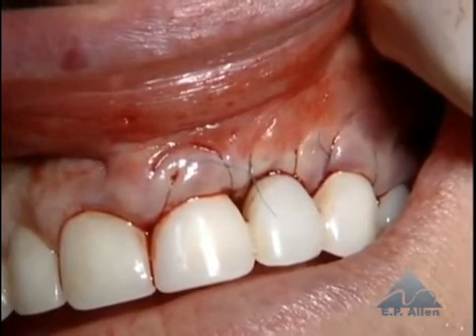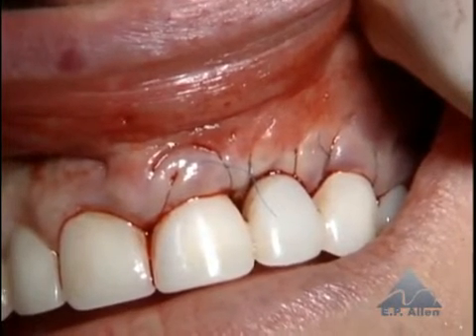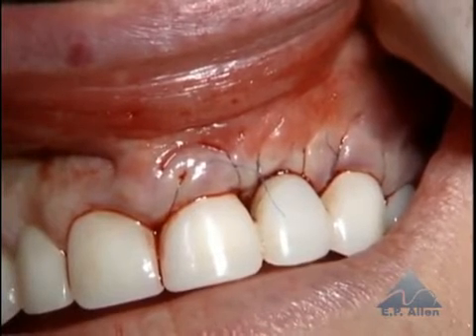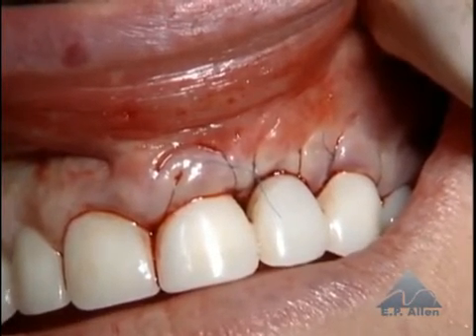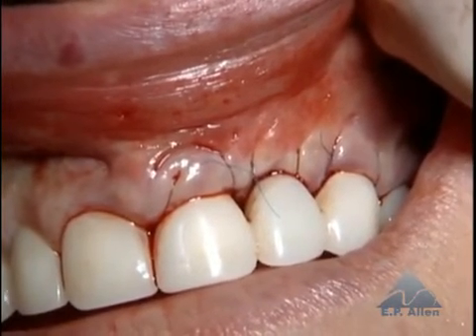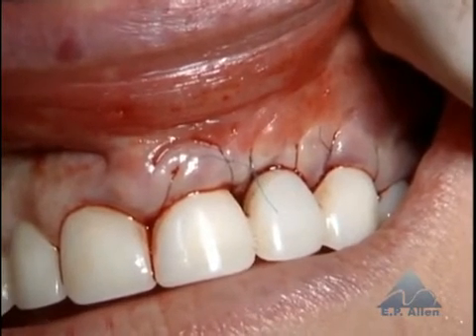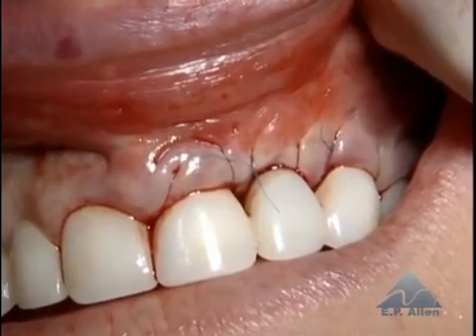If we're able to maintain the facial position of the tissue on the central, then we will do a scalloping of that tissue, which will give us an even length of the two central incisors. I'm leaving that tissue there now because I think it helps keep the tissue in a coronal position and over the graft. If I were to scallop it now and it were to draw back, then we would have a problem of insufficient tissue on the central incisor.